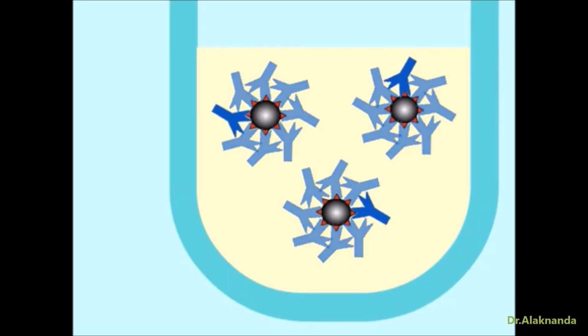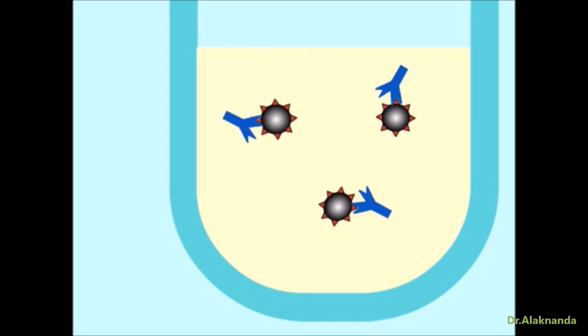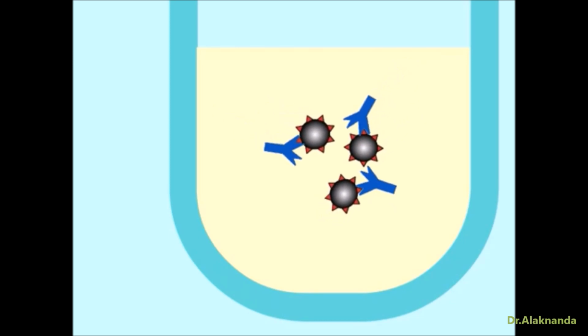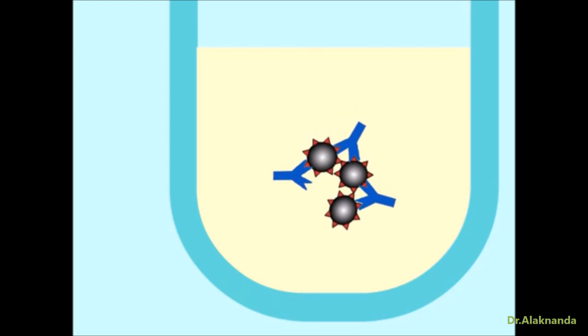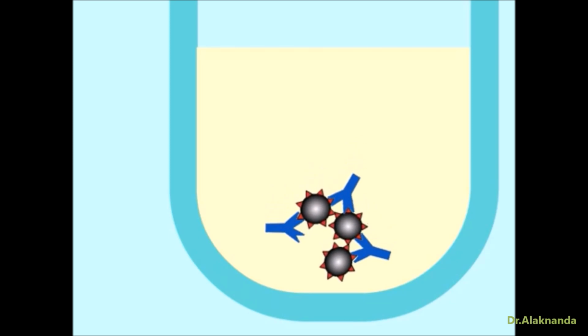Did you think of diluting the serum and then retesting it? By diluting the antibody in this situation, the amounts of antibody and antigen are closer to being equivalent with one another. Then the conditions for cross-linking can exist. Now when cross-linking occurs, a precipitate forms, and the button develops at the bottom of the tube, indicating a positive test.